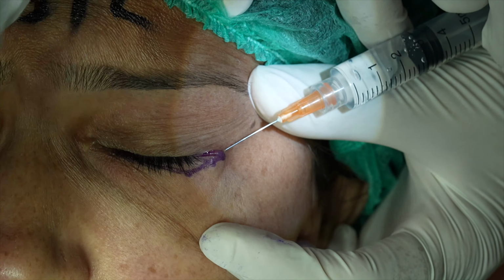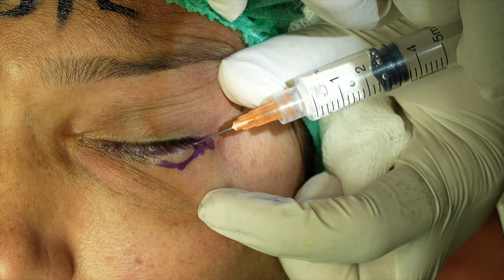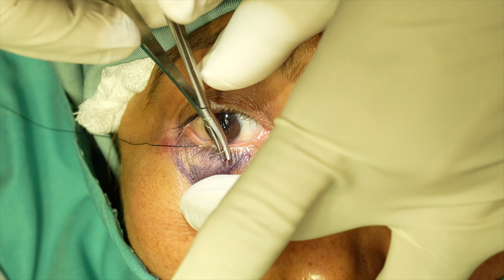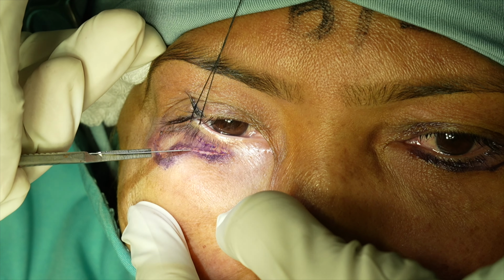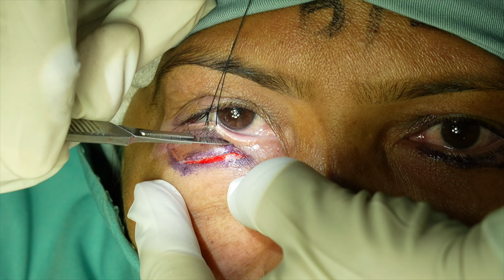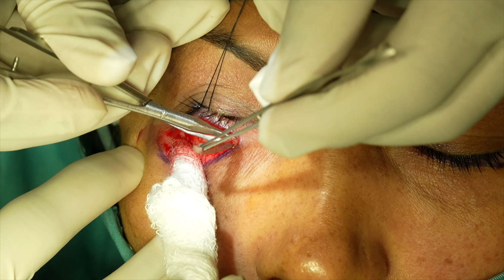Local anesthesia is infiltrated carefully into the lower lid. Silk traction suture is passed through the gray line. The skin incision is made using Colorado and 15 number blade. The skin flap is elevated and minimal skin excision is performed.